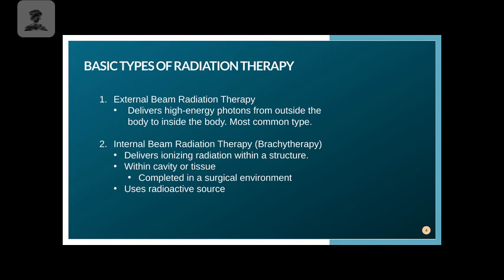Some procedures, they may just be lightly sedated, or they may be numbed in the local area, depending on the invasiveness and where the tumor is located. It just depends, but a lot of times they are sedated. So we're using that radioactive source, and I will show you some images of what that looks like.